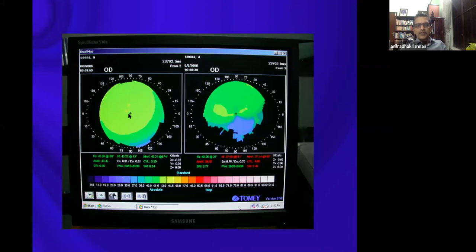This right eye is perfectly normal, while in this one you can see that this area is very flat. Why is it so? I asked the patient to look up and then I took a keratograph. If the patient is looking up, the peripheral cornea will come into view, and so it will be much flatter. So you will get totally abnormal values. You have to be aware of that. So you have to go back and look at the keratograph if you have any abnormal value.